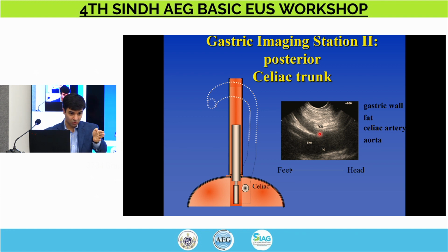But as you're tracking your aorta and moving down, you come to a double barrel sign. So it's like a double barrel gun. This is the first barrel. That's typically your celiac artery that you track down and it trifurcates. And then right beneath it is the SMA.